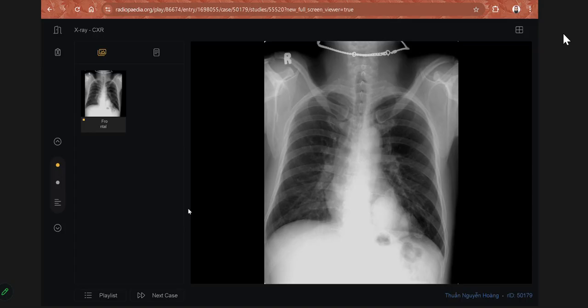Sir, I would like to know the history of the patient. Yeah, 40-year-old male. The patient has no clinical symptoms. Okay. So, sir, the patient is a 40-year-old male, and I could see a retrocardiac opacity. So, I would like to see this on a CT chest, as it could be in the lung or in the mediastinum. I would like to confirm this and characterize it further. However, I could not see any obvious rib destruction or any calcification or fat component within this opacity. There are no effusions, just a rounded left retrocardiac opacity. Okay. So you see a retrocardiac opacity.